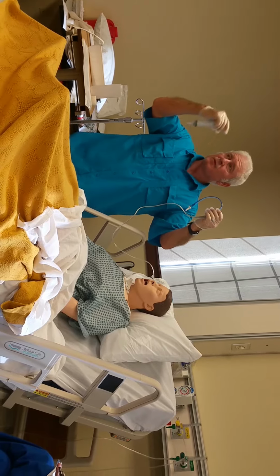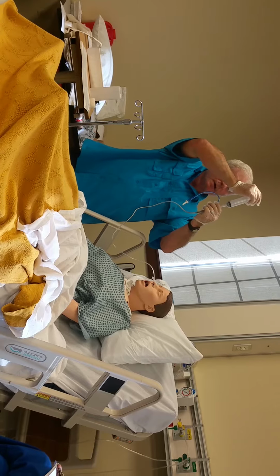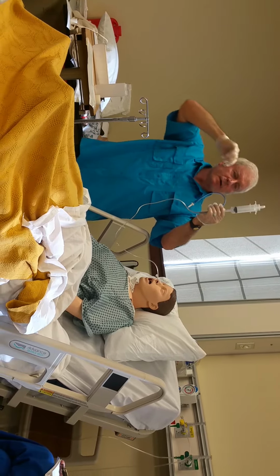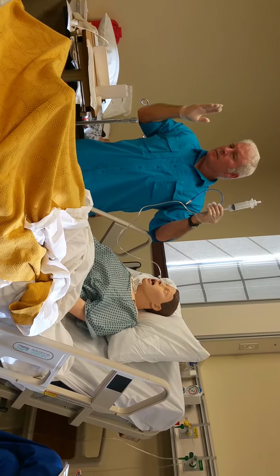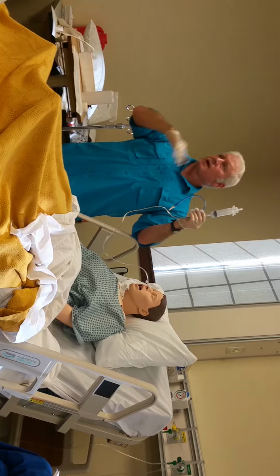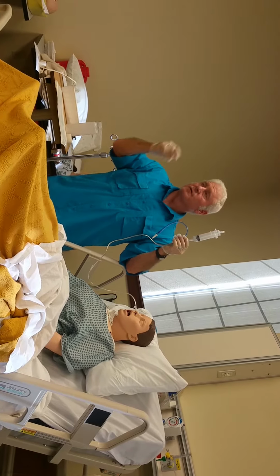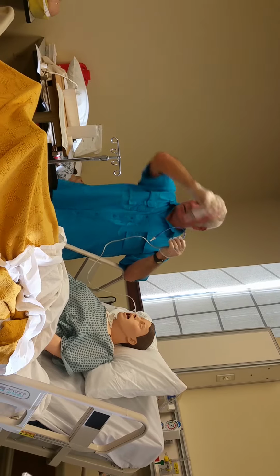We're gonna put it back because there's electrolytes and there's different things in there. So there's 60. Oh, that's about 15, so he's got 75 of residue. Look at your book. The book says anything 100 or less, I think, look it up in your book. If it says 100 or less, you replace it, just put it back. So I got 75, I'll put that in there.